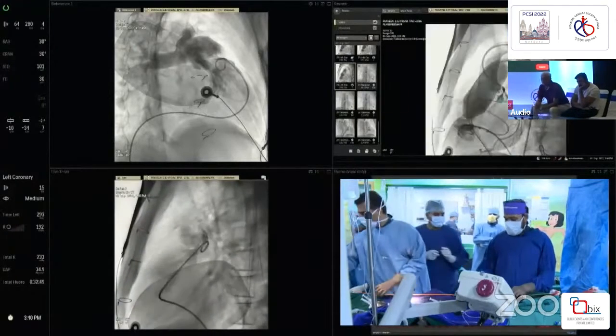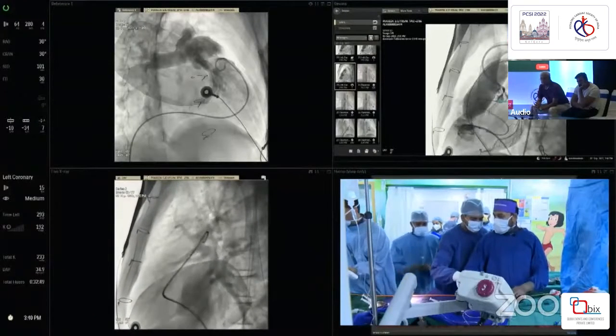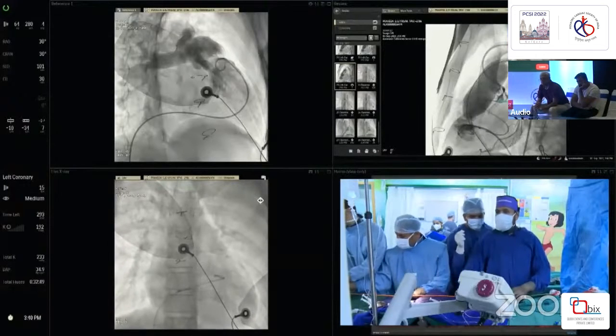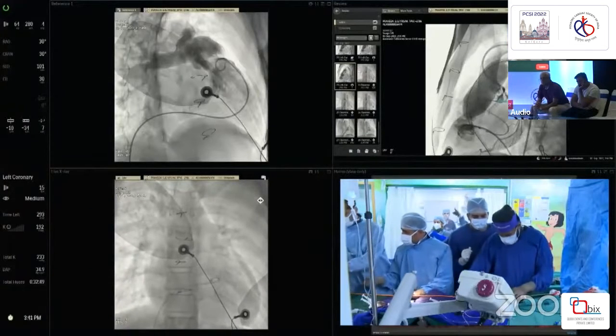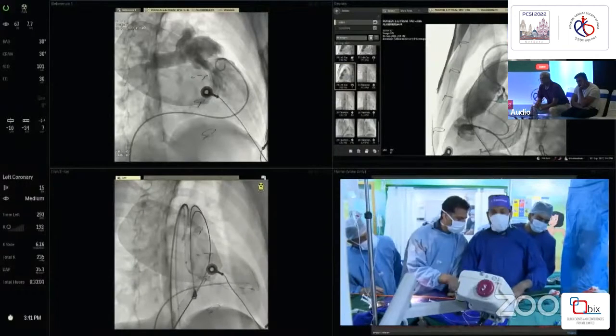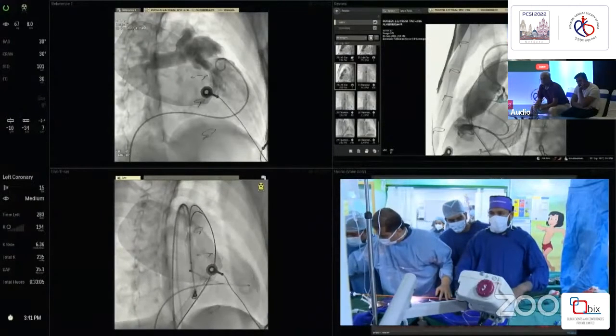Hold both wires, please. I want to hold both wires. Somebody help Dr. Sangatuvelu. Just 1 minute, Muthu. Just wait. Okay, ready? Okay, fine. Let me push it. Wait. Hold the wires, please. Yes, sir. Holding the wire.